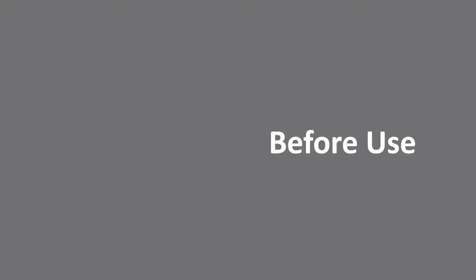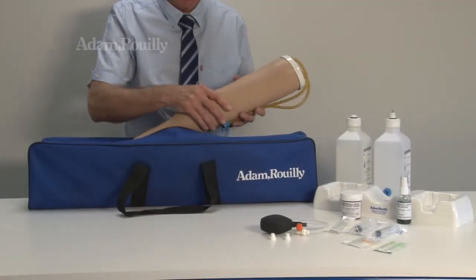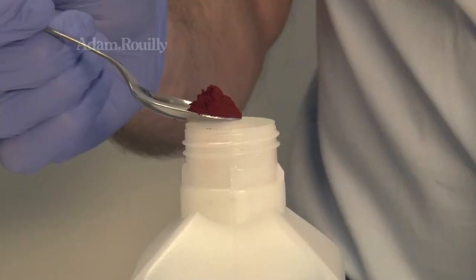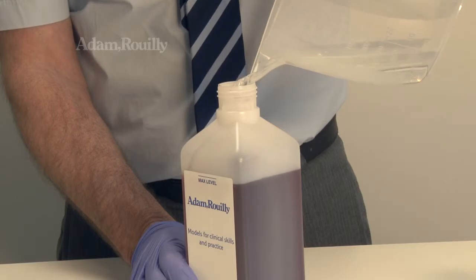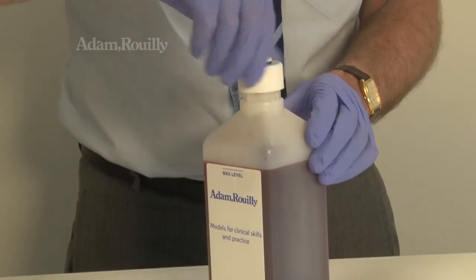Before use: The arm uses a unique and leak-free pressurised blood system. To set up, use one teaspoon of mock blood powder and add this to a blood bottle. Fill the bottle with water, observing the max level line, and replace the bottle cap.